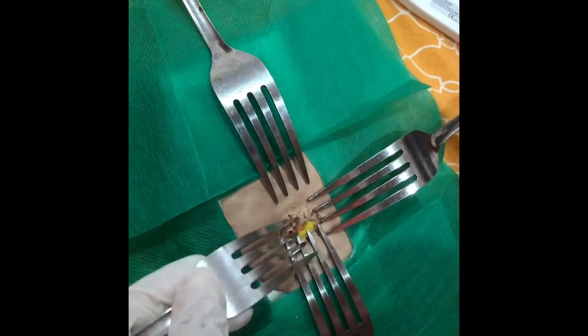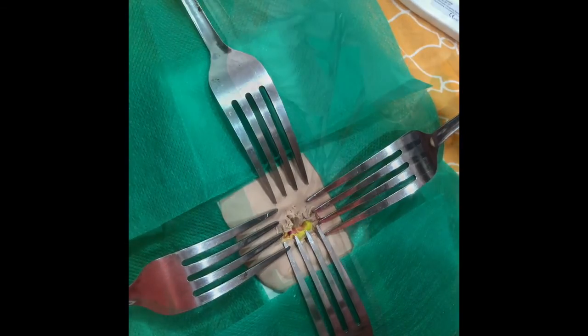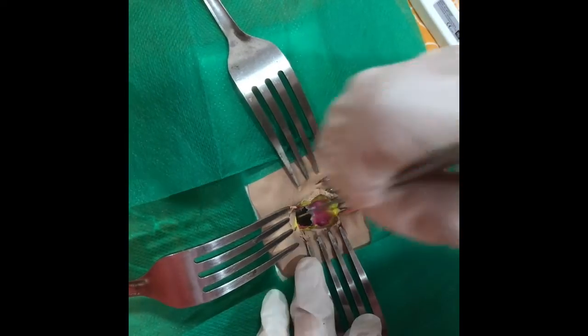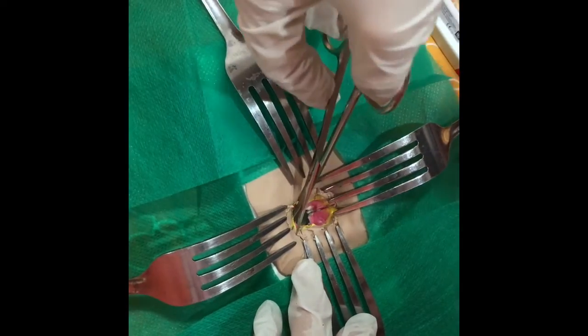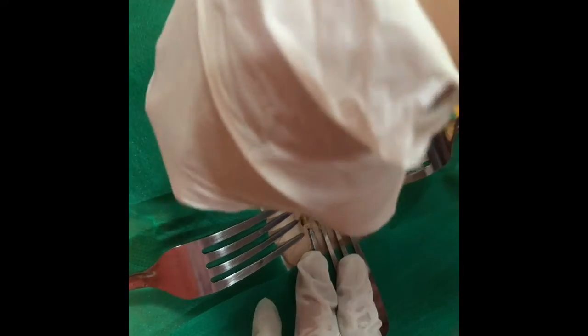It is imperative that the surgeon communicate with the anesthesiologist prior to entering the airway. In the intubated patient, it is recommended that the cuff of the endotracheal tube be let down temporarily so that it is not perforated with entering the airway. The tracheotomy should be created between the second and third, or the third and fourth ring.